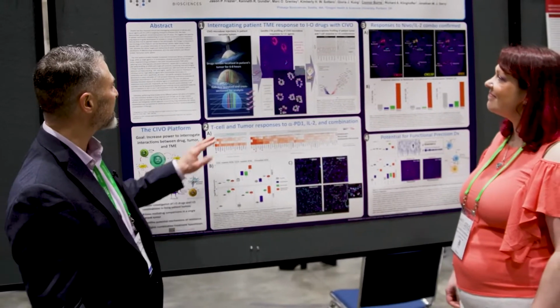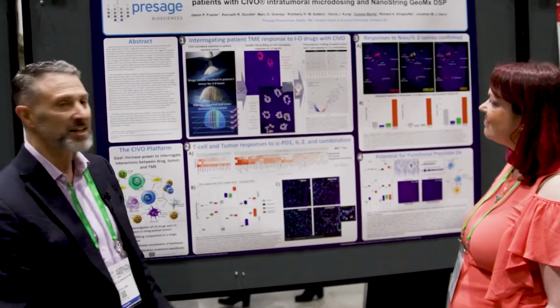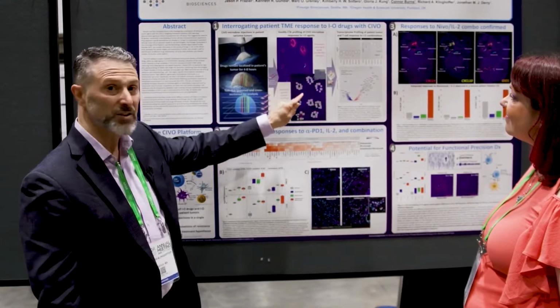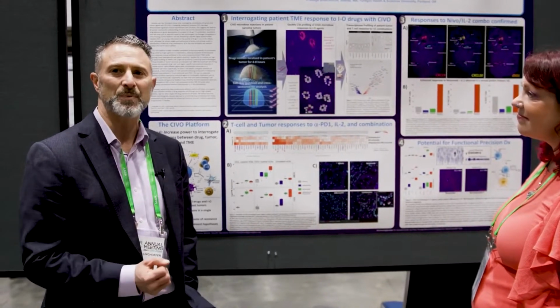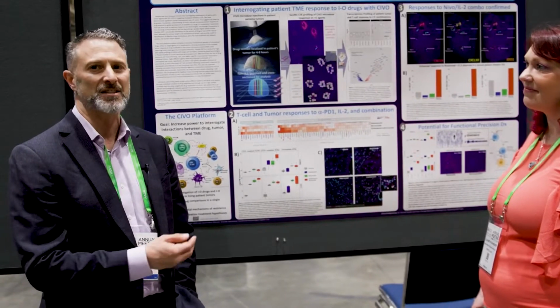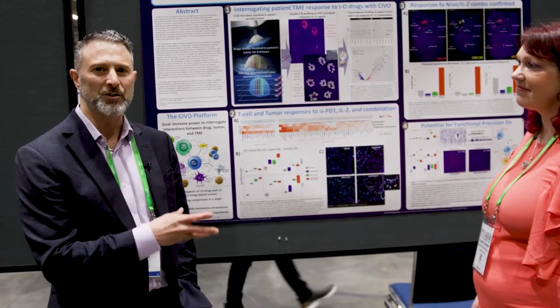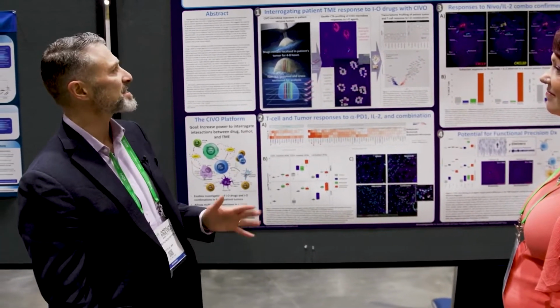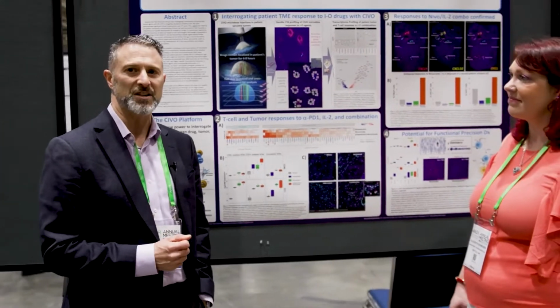So now we can take all these trackable locations of our drug microinjections, and they're trackable based on a component of our technology, which are these little fluorescent microspheres, and create regions of interest for Nanostring GeoMx DSP analysis, and cast a wide net to see what type of responses are elicited to either single agents or combinations. And these can be investigational agents, FDA-approved agents, small molecules, biologics, or combinations thereof. This is a study in patients with soft tissue sarcoma.